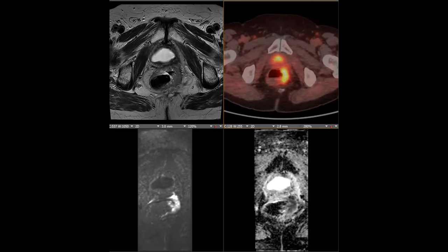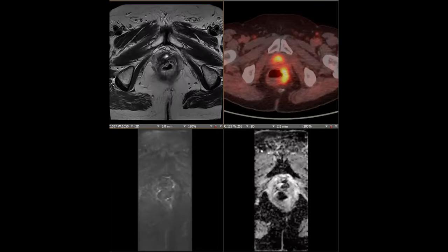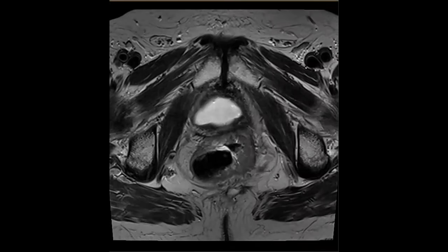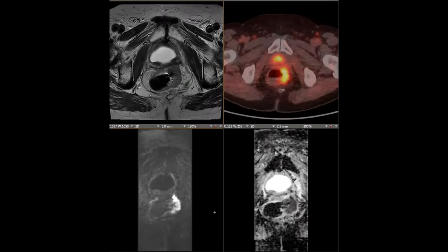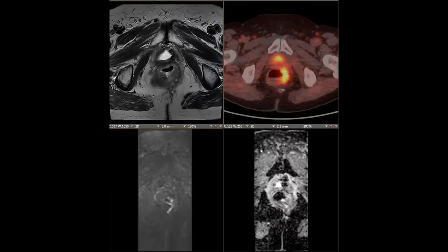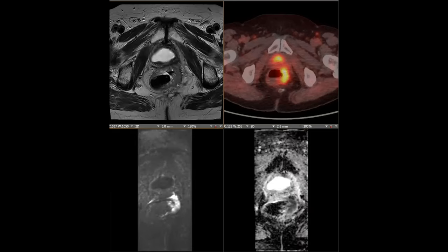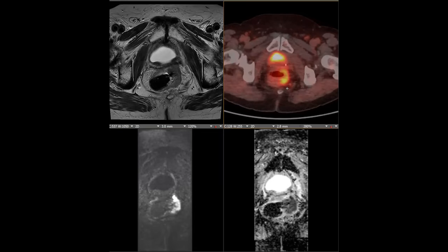And so they opted for a prostate MRI, because it could be a prostate met, that's what they were worried about, or another primary cancer. On the MRI, there is asymmetric thickening and diffusion restriction in the left, I guess this would still be low rectum, within 5 centimeters of the sphincter. So they biopsied it, and this is actually a second primary adenocarcinoma. So that's kind of cool.